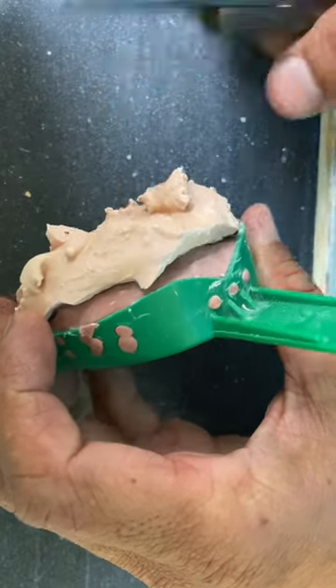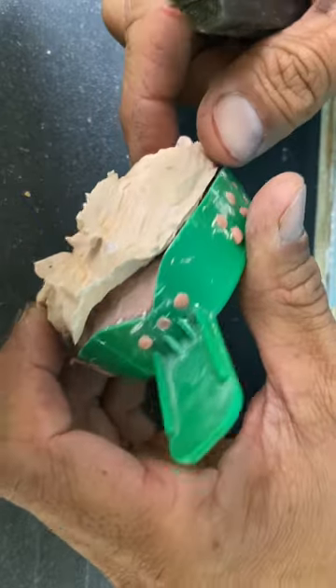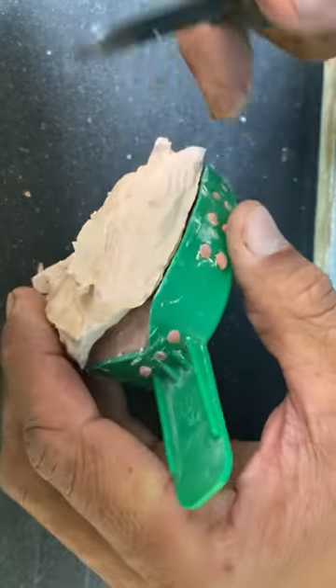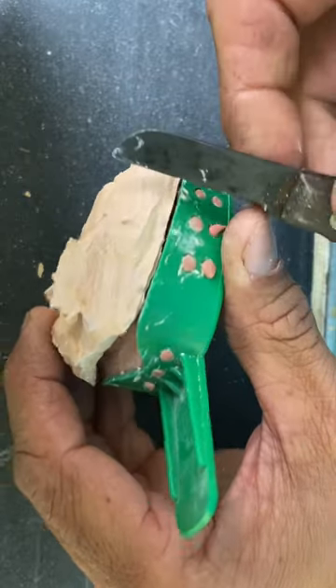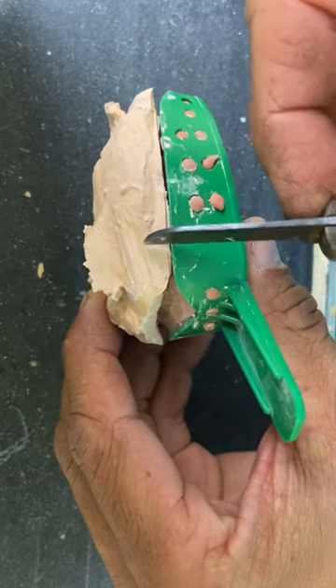I used the wrong material to duplicate my model — it's heavy body putty, so do what you want. A lab tech when I was working in Belgium taught me one way to get these out without breaking the front teeth: make sure it comes out of the path of draw of the front teeth.